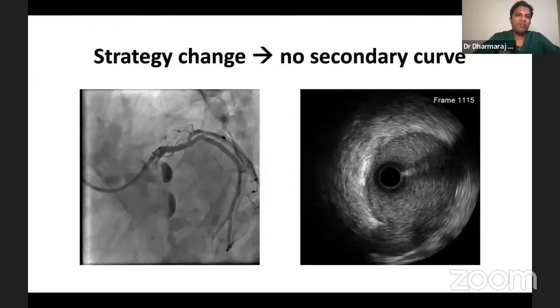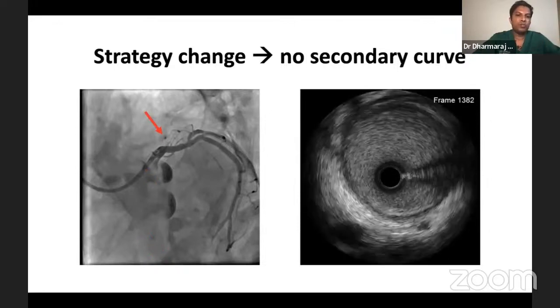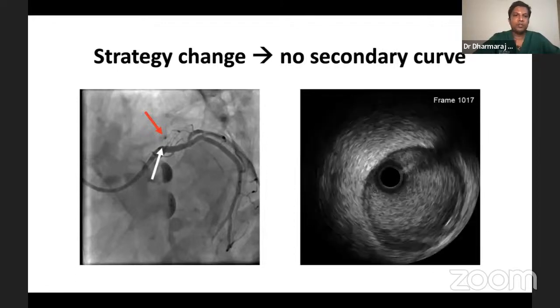But the other clue that I found from the angiography is the stump of the distal collateral from the spider view, which is more superior than where I wanted to puncture. And so this makes a narrow angle CTO ostium a far likely possibility.